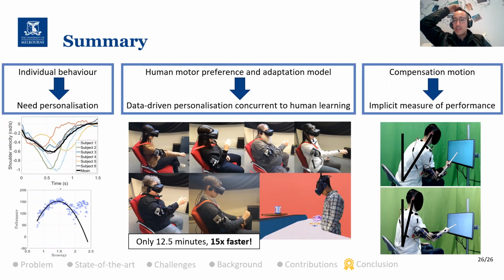So we haven't really looked at long term. This was within one session, an hour or less, of 15, 20 minutes. Practically speaking, I would say that you would stop it at that point, just because you wouldn't want it to change or something to happen, like what happened with the people that have a different behavior, some sudden changes. You wouldn't want that to happen while the person is actually using the prosthetic rather than doing the personalization task.